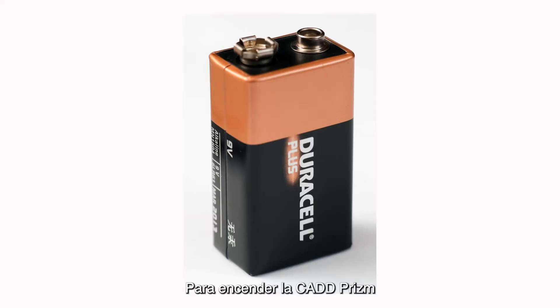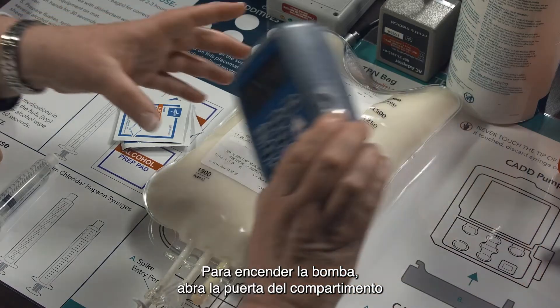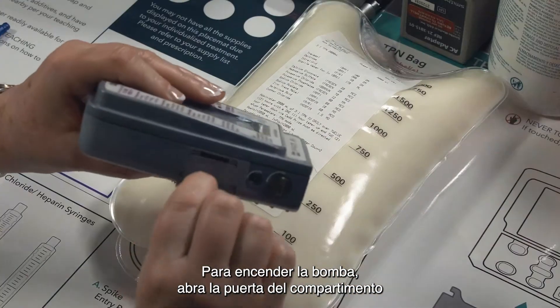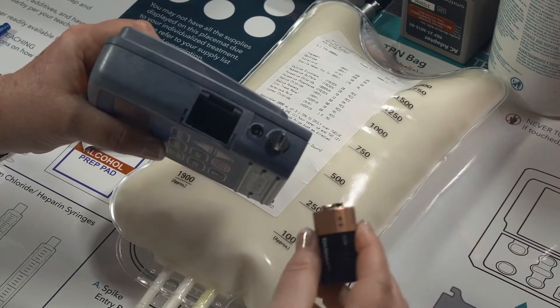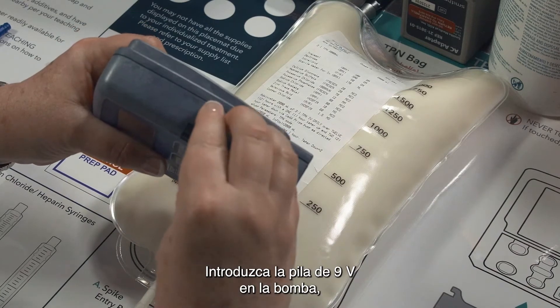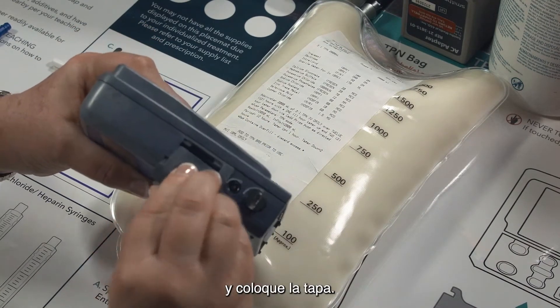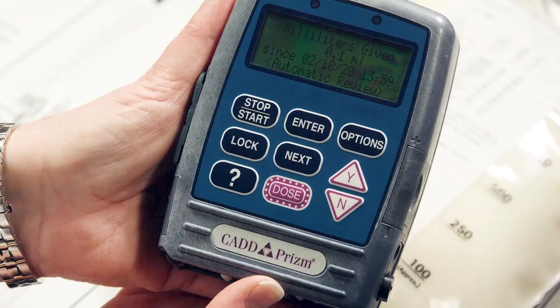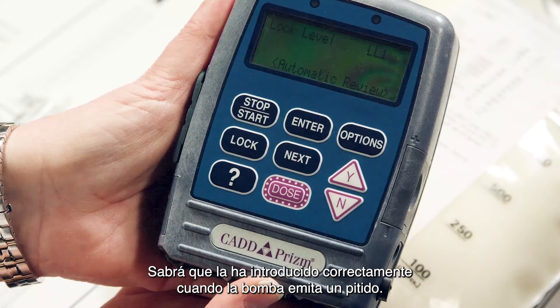The CAD Prism is turned on by inserting the 9V battery and turned off by removing it. The 9V battery must always be in the pump during use, even when using the power pack. To power on the pump, remove the battery door by pushing the white button and sliding the door off. Insert the 9V battery into the pump and replace the battery door. You know you have inserted it correctly when the pump chirps.